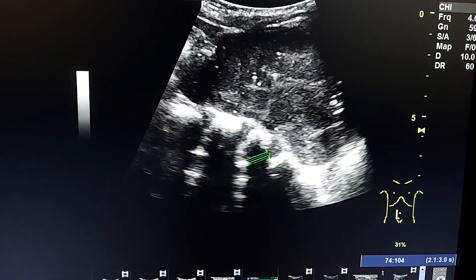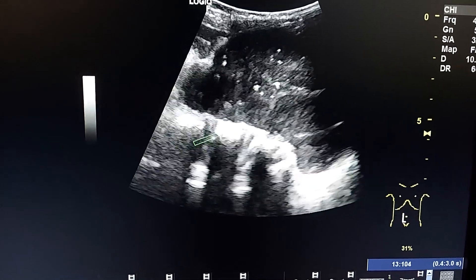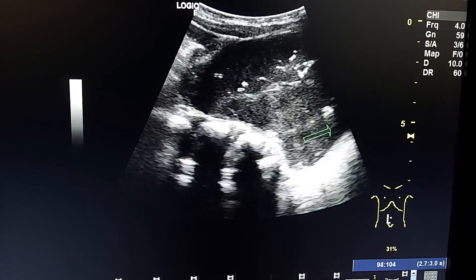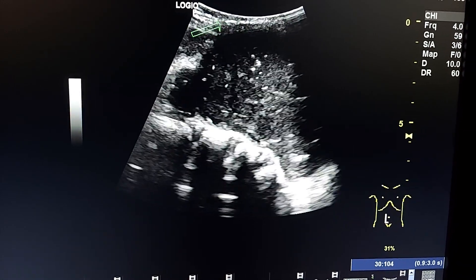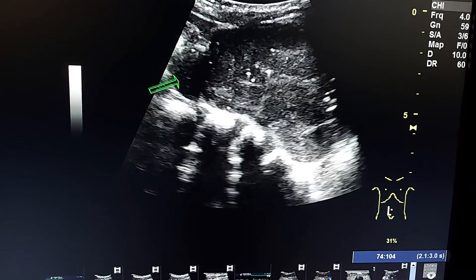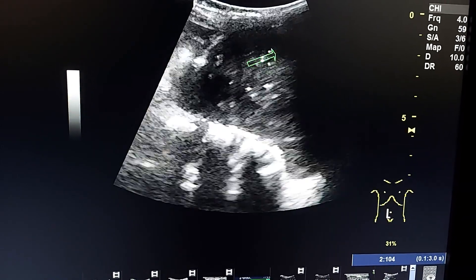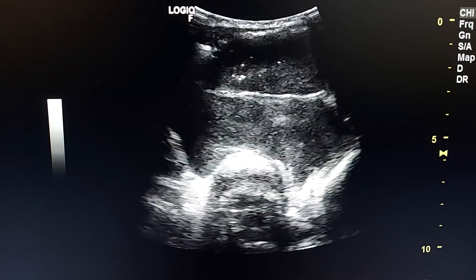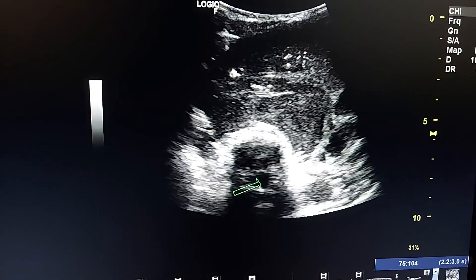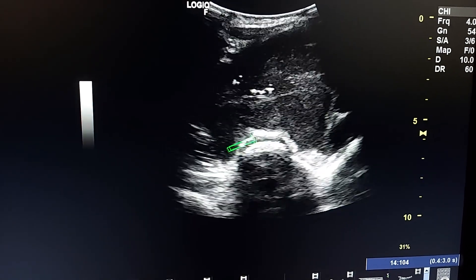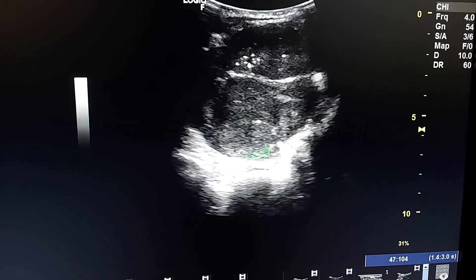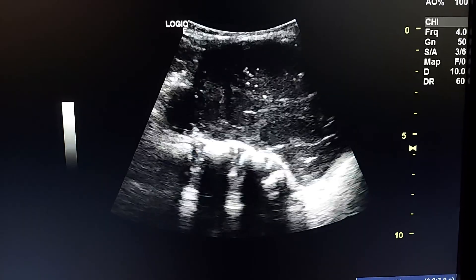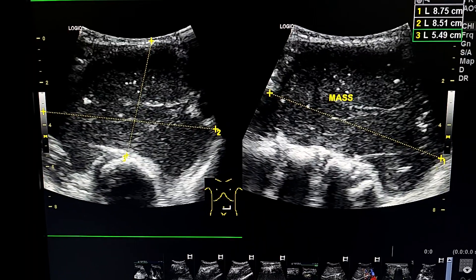We see the lumbar spine vertebrae, and here is the mass. It is in the pelvis, and here is the anterior abdominal wall. The mass is lobulated, very hypoechoic, and contains punctate coarse calcifications. This is a transverse section of the mass. We see the vertebral canal and the lumbar vertebra — the anterior surface is surrounded by the mass. Here are the measurements.